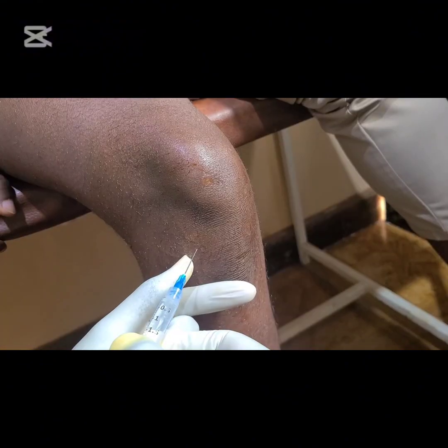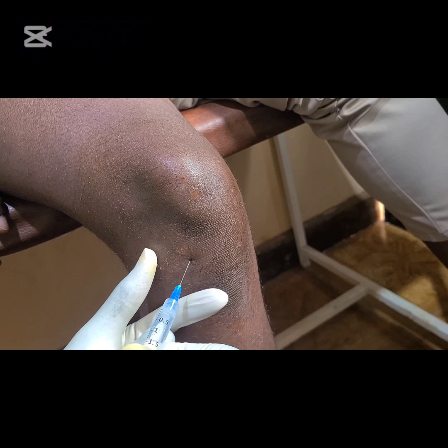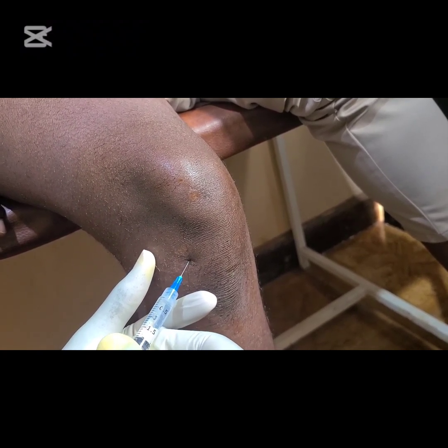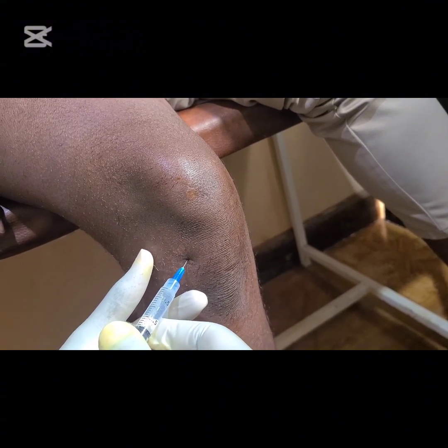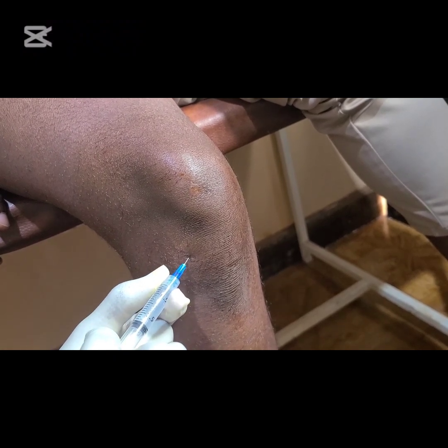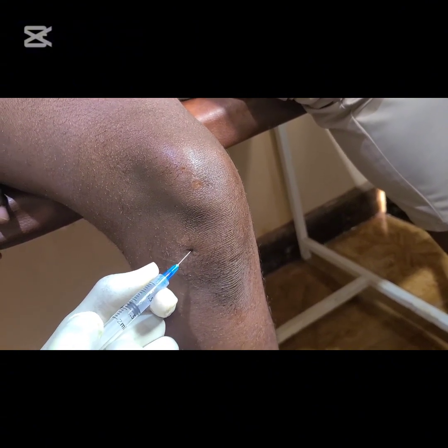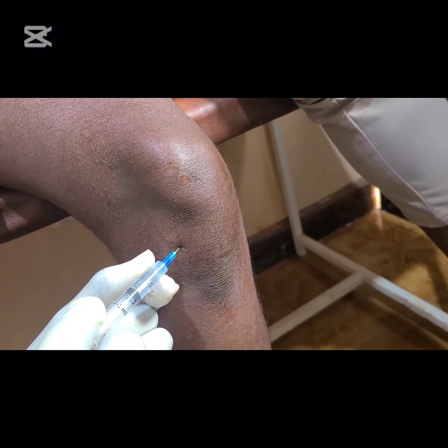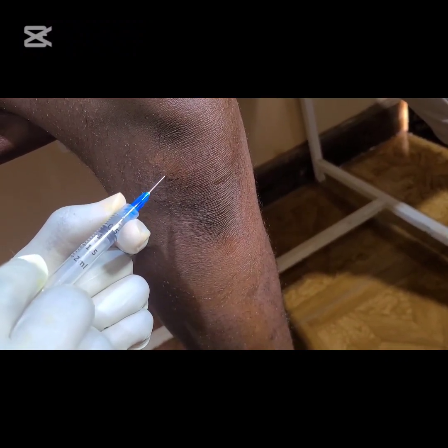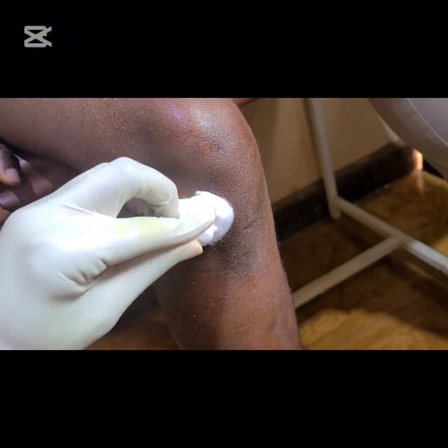So after that, we shall infiltrate our skin and the deep structures with local anesthetic, and this will help to reduce a bit of pain. Yes, of course, we shall introduce our needle into the skin and to the deeper structures as we continue to aspirate to see that we are not in the vessel, because our aim is to infiltrate the surrounding structures other than the vessels. So we shall administer it as we move to anesthetize the surrounding structures as well. Then after that, we shall give it a bit of time, around a few seconds to a minute.